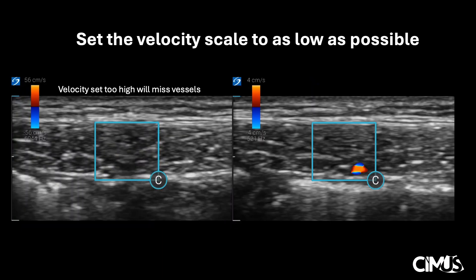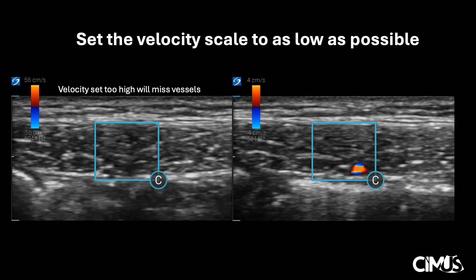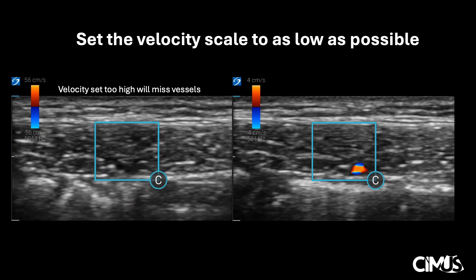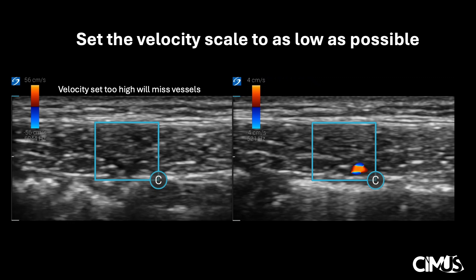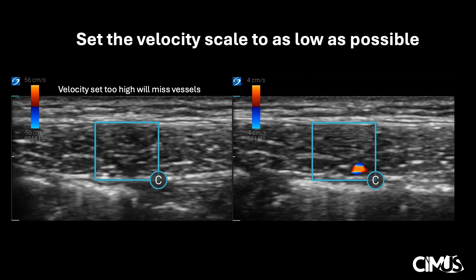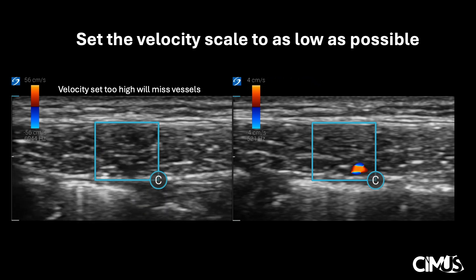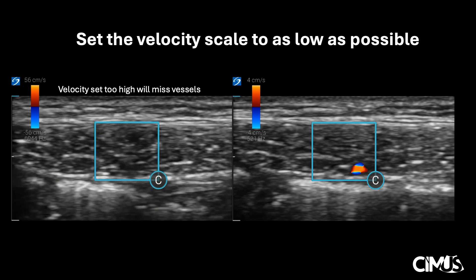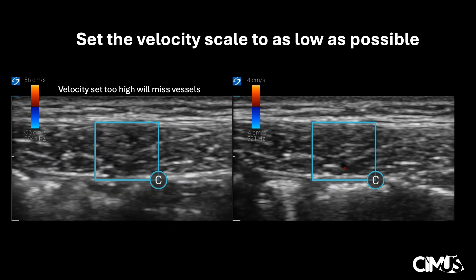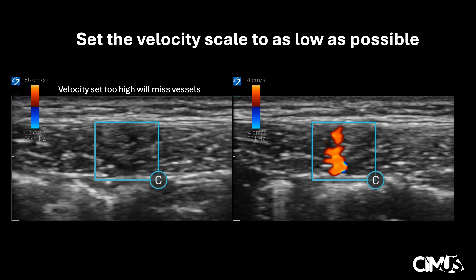Now let's go over common pitfalls. On the left, we could be fooled into thinking there is no vessel in this area. However, looking at our scale, our velocity is set very high at 56 cm per second. Ultrasound is only able to pick up vessels at a minimum 10% of the set scale, thus any vessel lower than 5.6 cm per second will be missed. On the right, we see that there are indeed vessels, now evident once the scale is adjusted to a lower velocity.